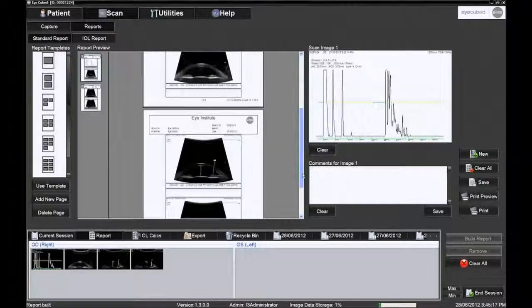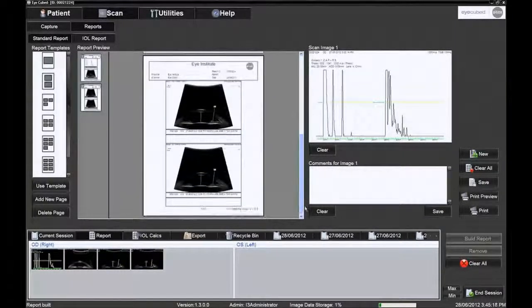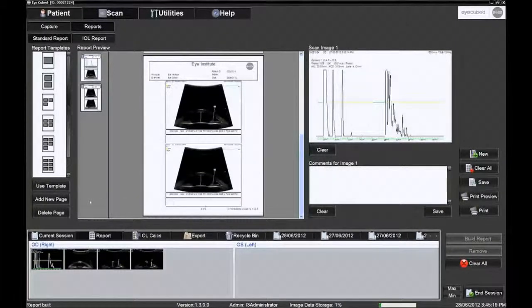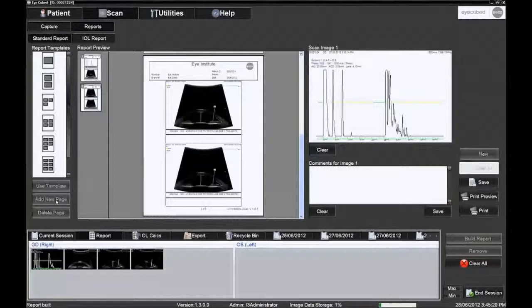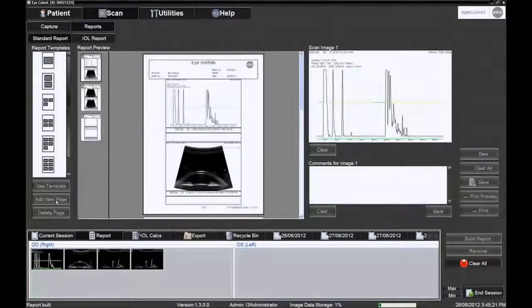If needed, more pages can be added to the report by clicking the Add New Page icon.